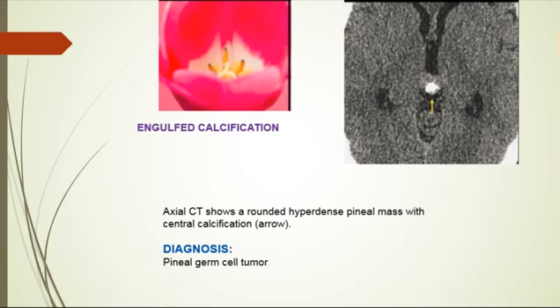So what are the germ cell tumors that can happen here? They include germinoma, teratoma, embryonal carcinoma, endodermal sinus yolk sac tumor, and choriocarcinoma. Germinomas are characteristically seen in young males, appear hyperdense on CT with avid homogeneous enhancement, and can be multifocal with additional lesions in the suprasellar region, what we call bifocal germinoma, also in the basal ganglia and the thalami. These tumors are very sensitive to radiation and or chemotherapy, often resolving completely after treatment.